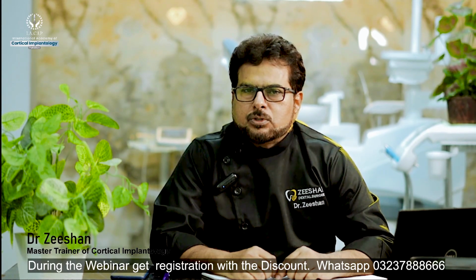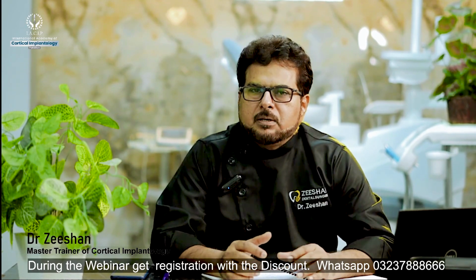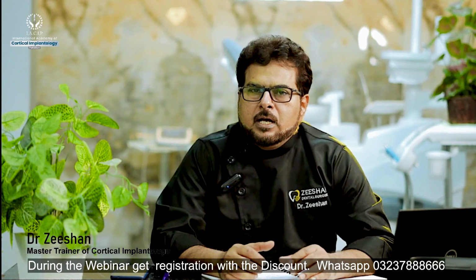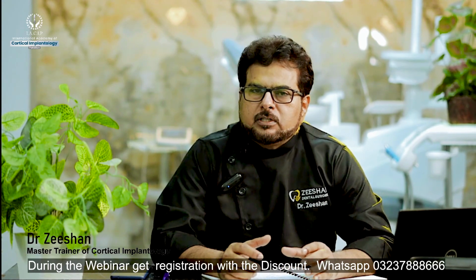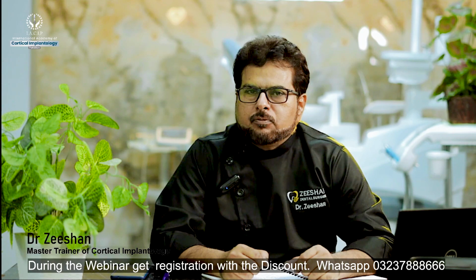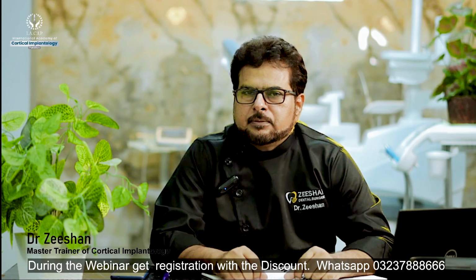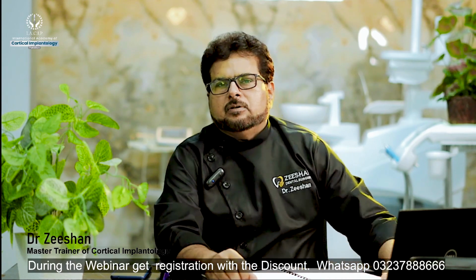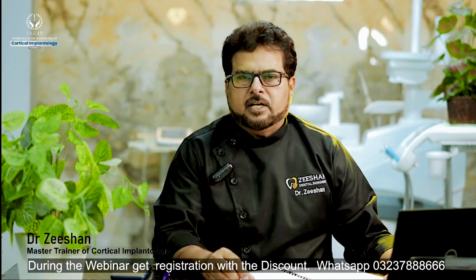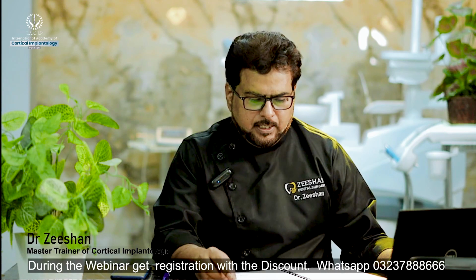So the cases which we are going to select for immediate loading, most of the time they have no bone. So to achieve the bone knowledge, we can go for CBCT to find the bone density, location of the nerve, and the sinus positioning, and other data we can collect from the CBCT and panoramic x-rays.